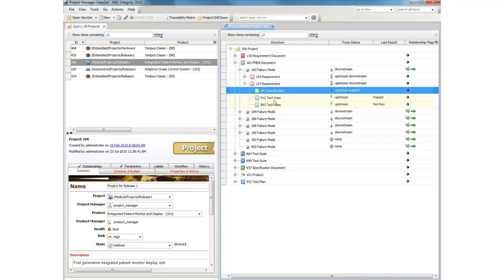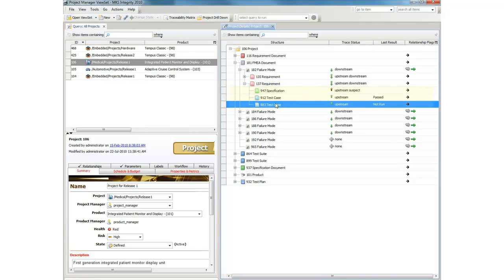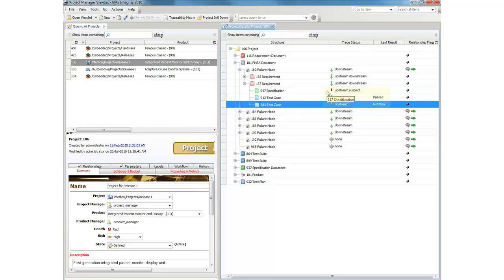We can also see that the specification itself has been validated by a test case. We also can see the last run result of the test cases and review the impact of requirements change. In this case, causing a suspect trace relationship to the associated specification.